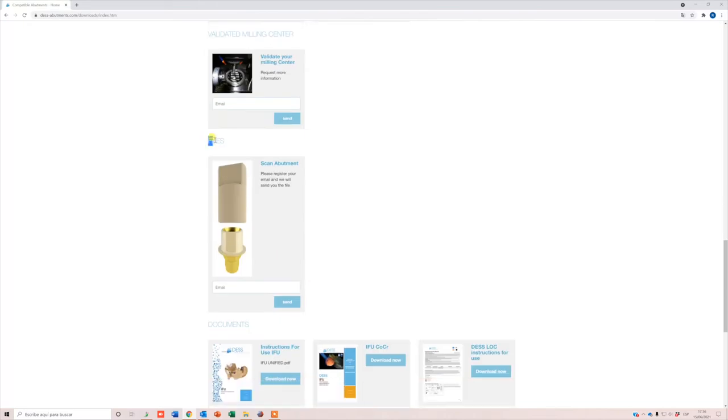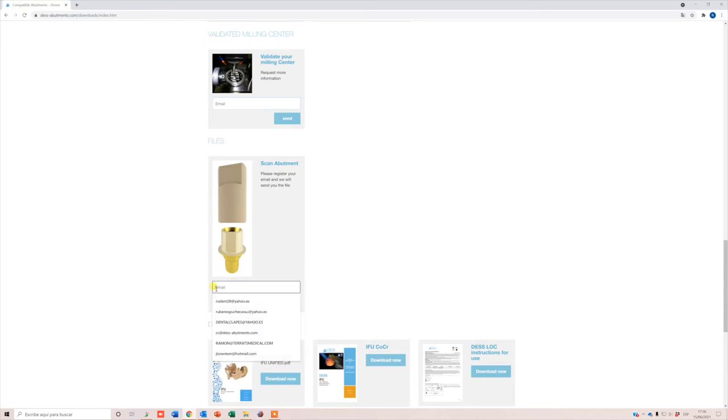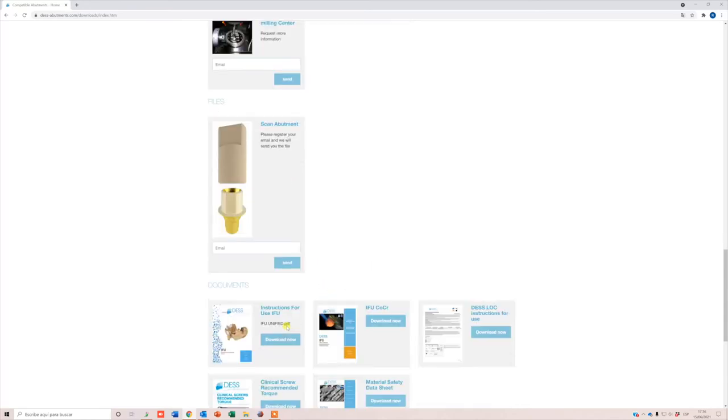Also, you can download the STL files of our scanabutments on TyBase. You only need to print them on a 3D printer.